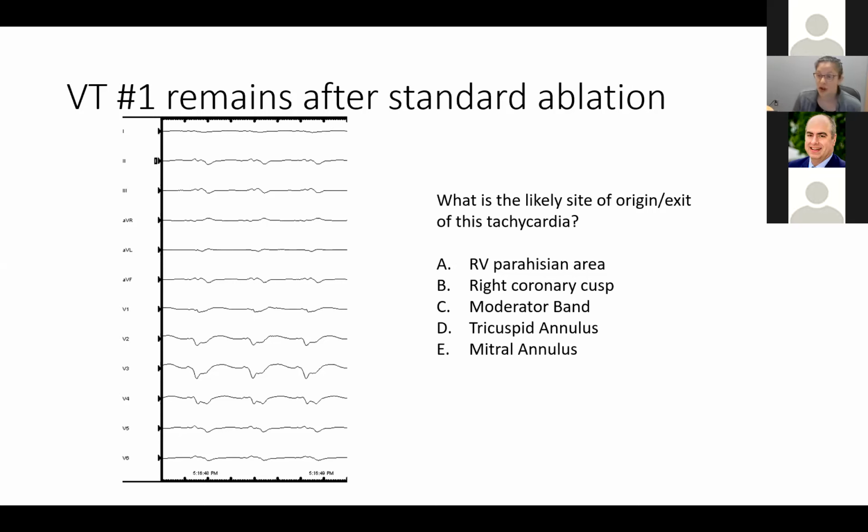Yes. So we actually use all, or at least I use all, unipolar pacing. We use a specialized His catheter that has an indifferent electrode that sits in the IVC, and we do unipolar pacing to avoid anodal capture. It's really helpful just to make sure you're capturing a very small area of myocardium. It helps with your electrogram fidelity as well.